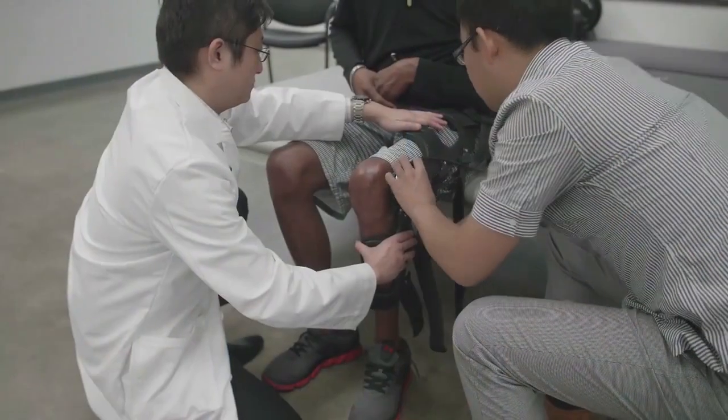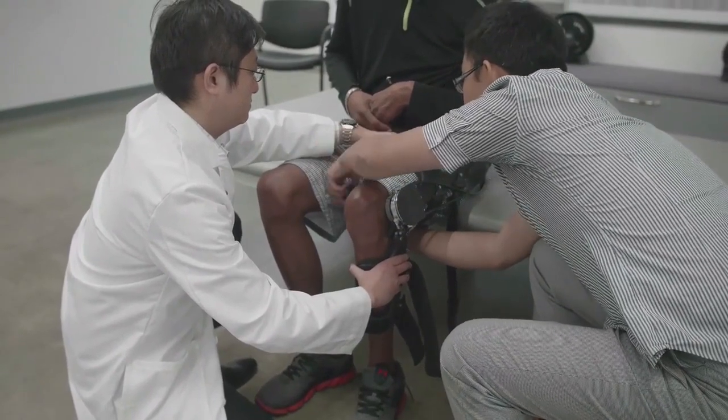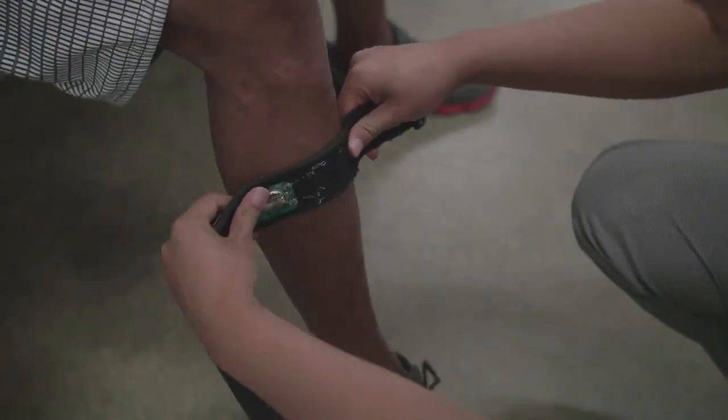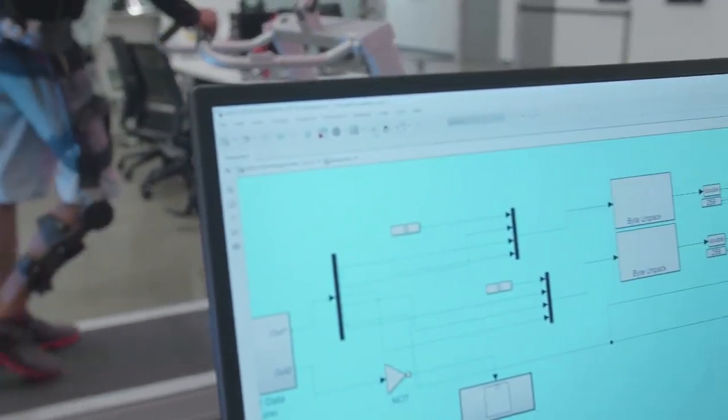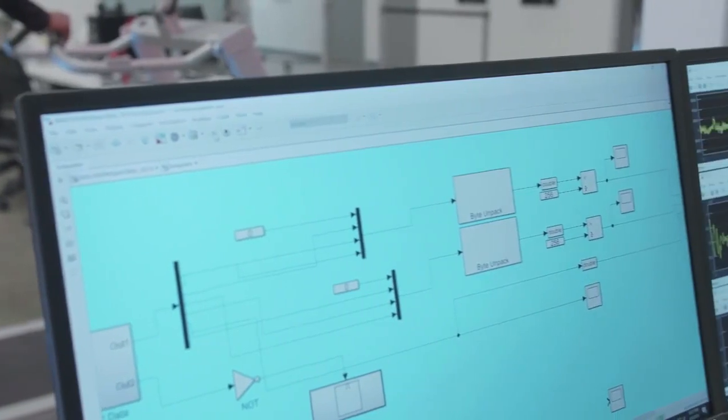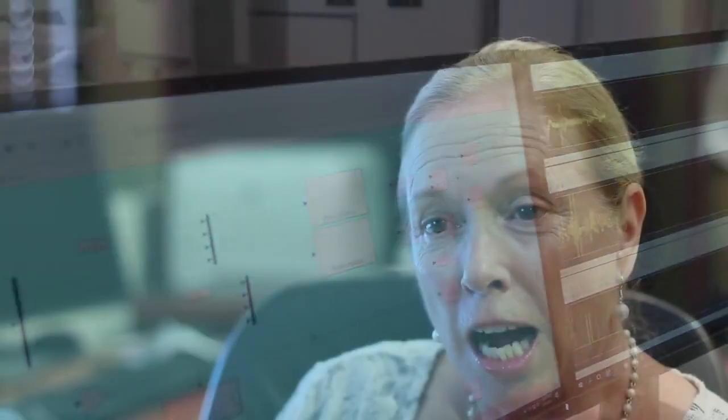Our medical center is the clinical collaborator with Dr. Sue's lab. Soft EMG sensor technology is a human-machine interface that monitors the user's physiology and varies the power assistance by maximizing the use of the residual or remaining function. Our group plans to conduct safety and efficacy studies to investigate the usefulness of this technology.